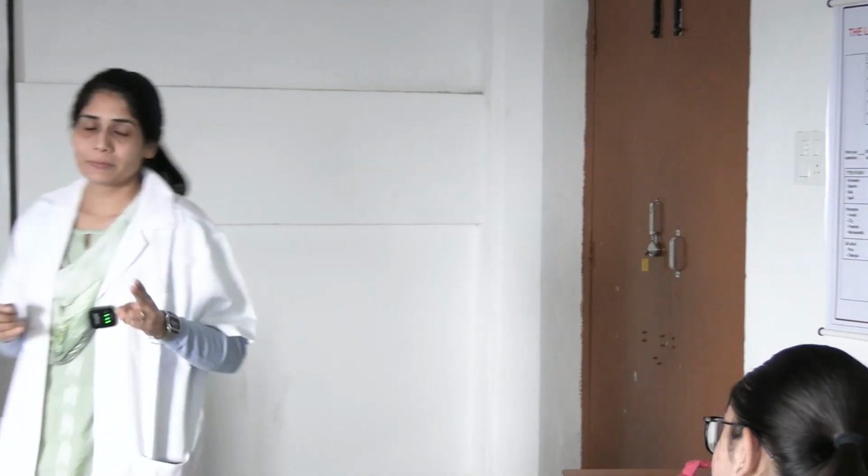What else is there in the blood? In the blood there could be bactericidal products such as complement, etc. So this blood needs to be diluted so that the bacterium grows. Okay, 2 points. Whatever I'm teaching you now, you're going to ask each other later so that you remember. Okay? So these 2 things you have to remember.